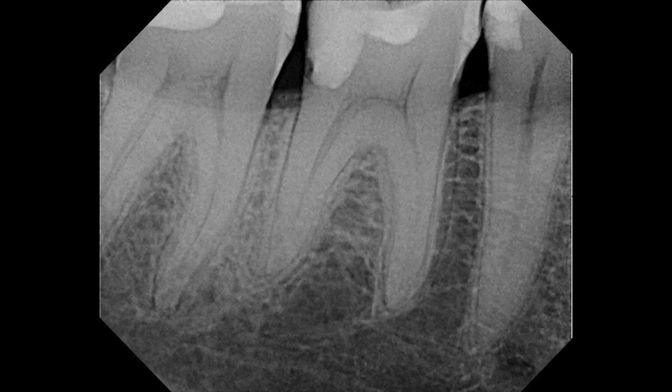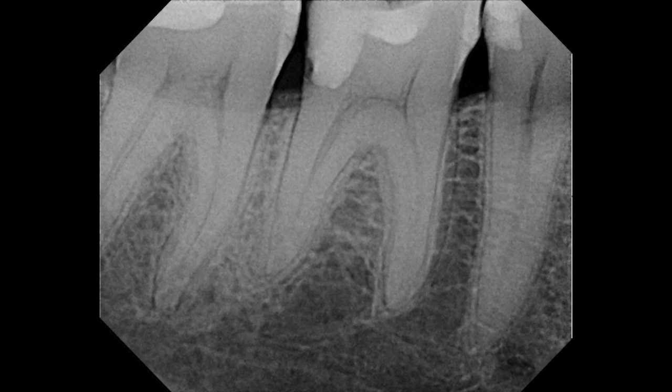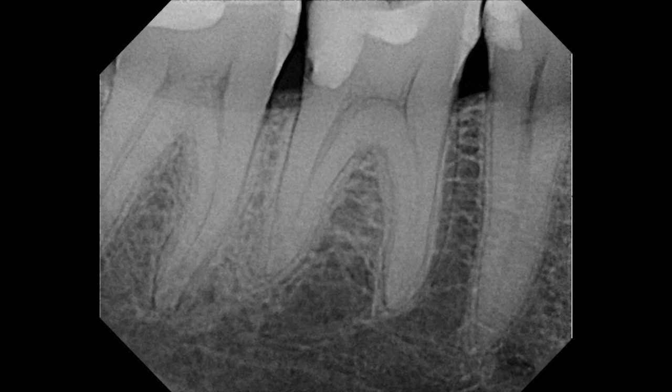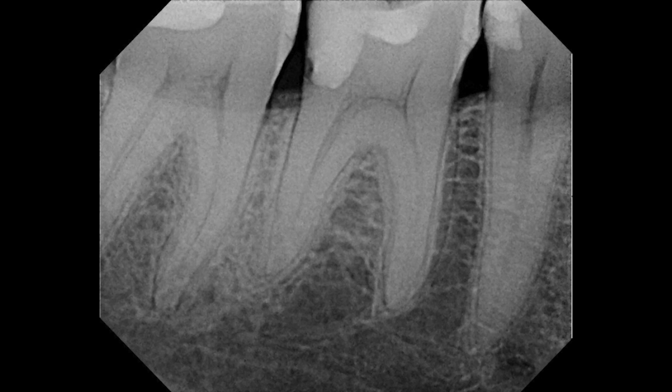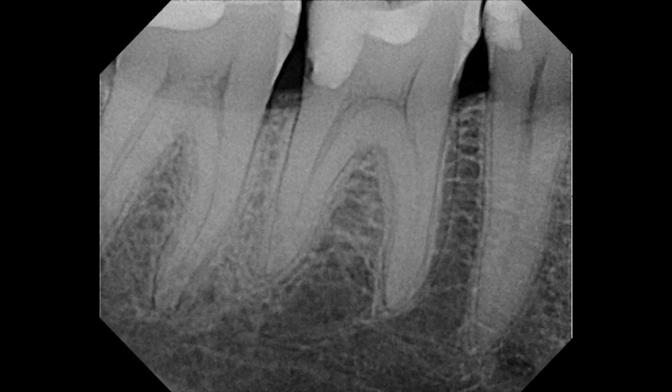Let's take a look at this case that I recently did using the Endosync and Endosync AI. It's a mandibular first molar and it has, as you can see, a little bit of calcification. There is a filling here that's present and it's actually cracked. This would be a case that we would classify as an advanced case because of the calcification, especially in the mesial root. By definition, an advanced case is one in which the 1502 hand file is having difficulty reaching the apex, which is what you would probably expect on the mesial roots of this particular case.